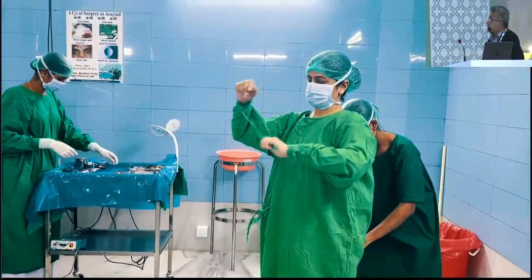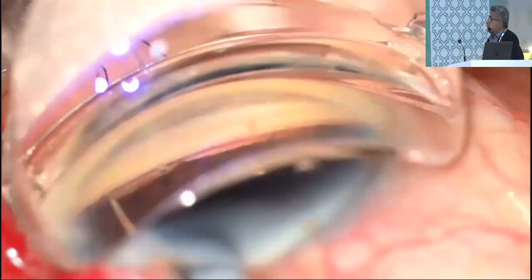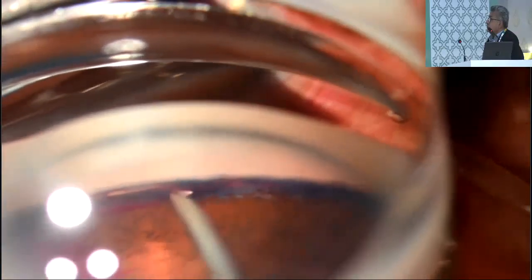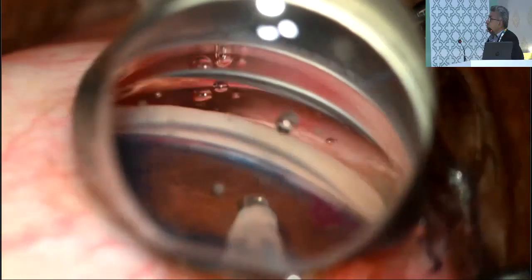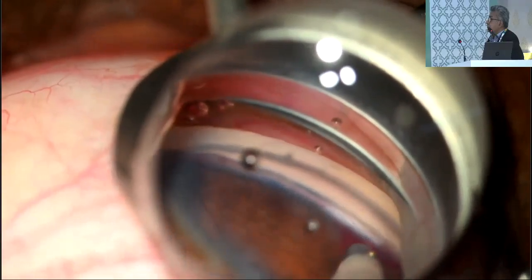Convinced by the evidence given by Mr. Blue and feeling confident, the fellow attempts BANG, KDB, and Tinito microhook goniotomy. Now that we've performed the trabecular excision procedure, let's see if the dye flows through the collector channels now that the resistance has been removed. I'm so excited! Let's take a look.